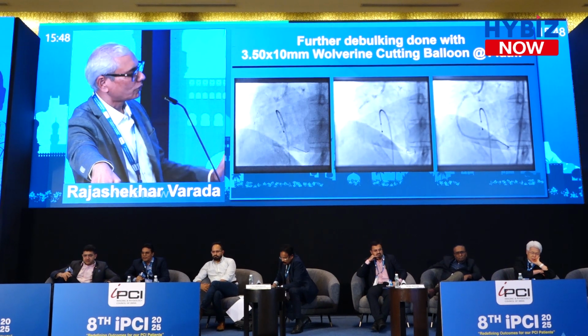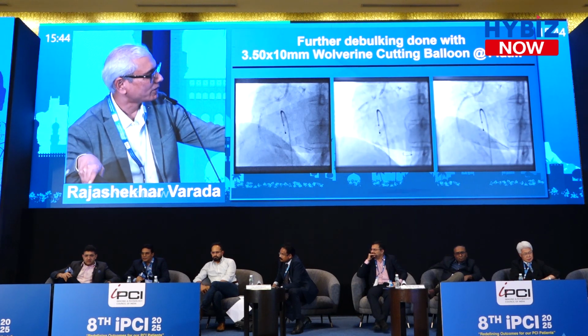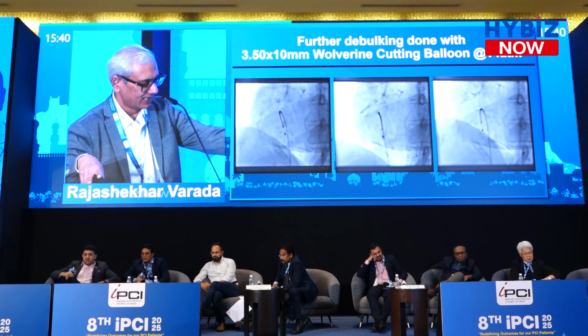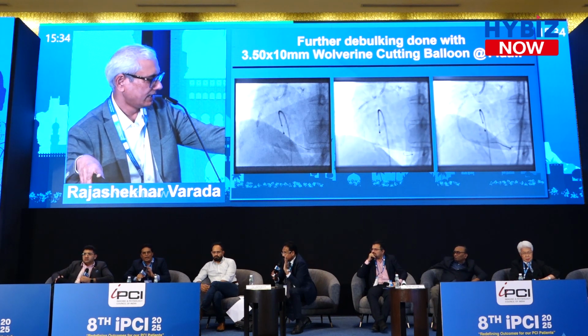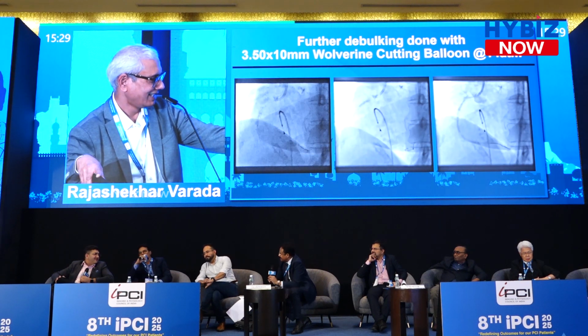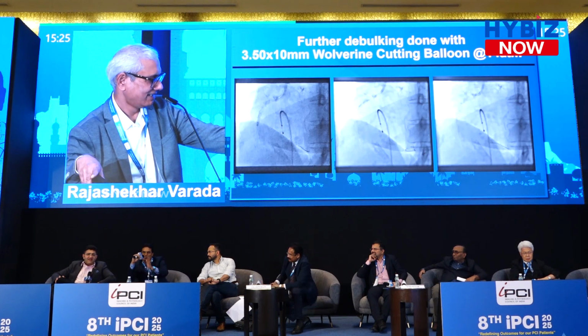So then I used a Wolverine cutting balloon. So this is a rotatripsy. So we've demonstrated all the 3 technologies here. I mean, interestingly, now we have softened the superficial area, the vessel superficial calcium. You have softened, because rota itself showed nice fractures, nice cuts.